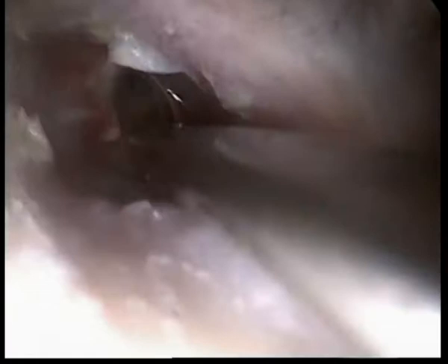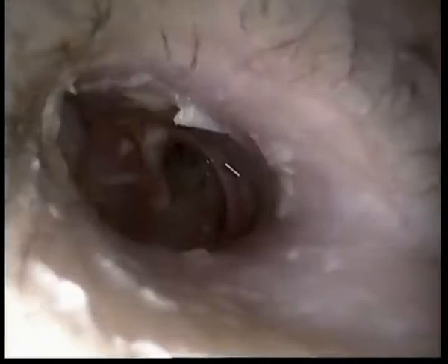So, moving back to the endoscope, nice, give me irrigation, please. Irrigation. Take this. There's a lot of irrigation throughout the surgery. You can see again my point when you go, how the straighten, align the bony ear canal with the cartilaginous ear canal. I also usually make the picture as magnified as possible. Give me the smaller scope. This is the smaller scope.